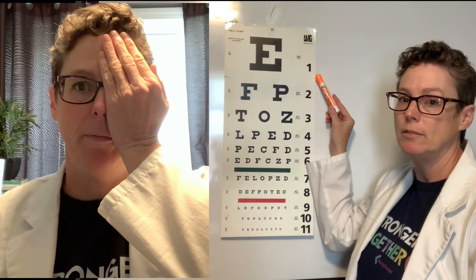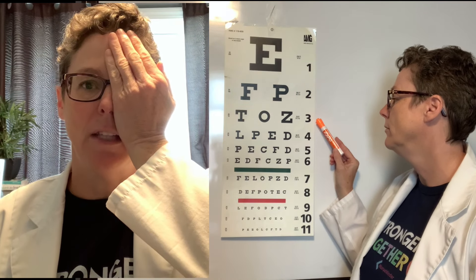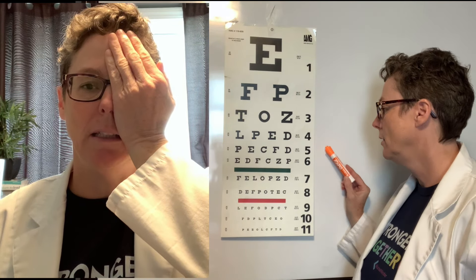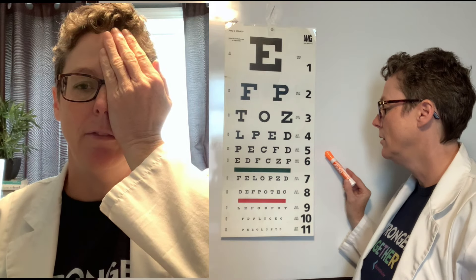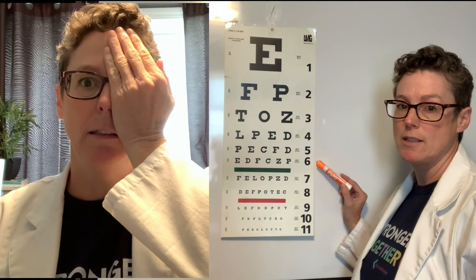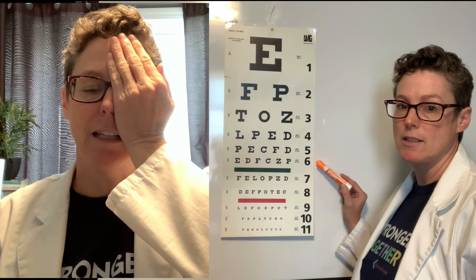Can you please read line one? The patient reads: E, F, P — line 3: T, O, Z — line 4: L, P, E, D — line 5: P, C, E, F, E, D — and I can't read that last line at all.